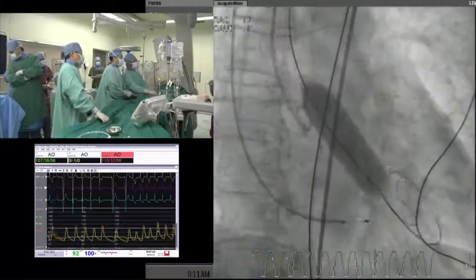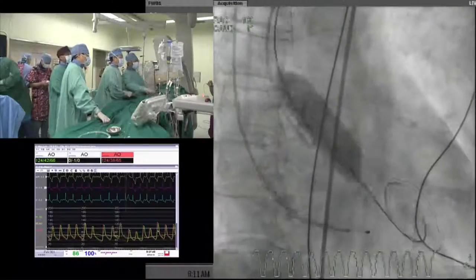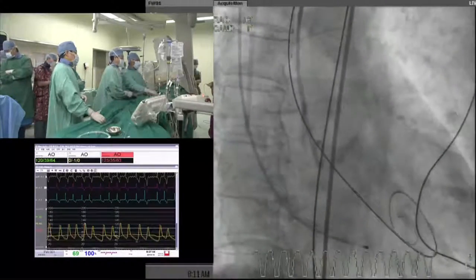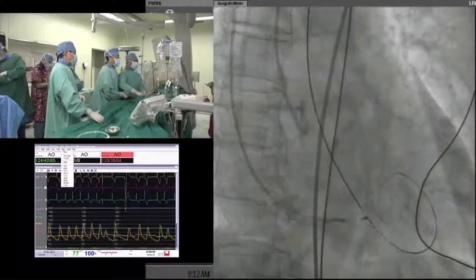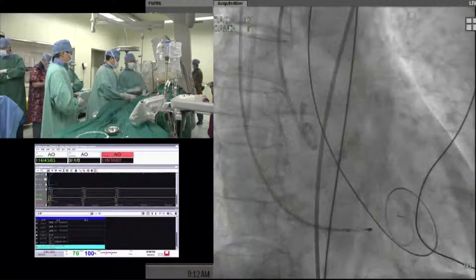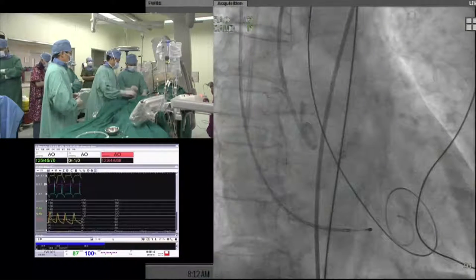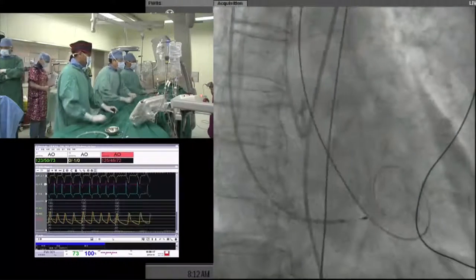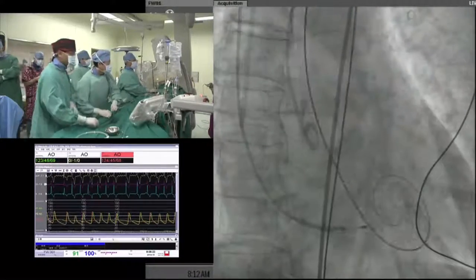I think this can confirm that it's too small. I'm afraid, because this is too calcified. We are concerned by the positioning of the prosthesis. In fact, it's not totally open, so it's difficult for the positioning. Is the Safari wire working very well for you? Yeah. Okay.